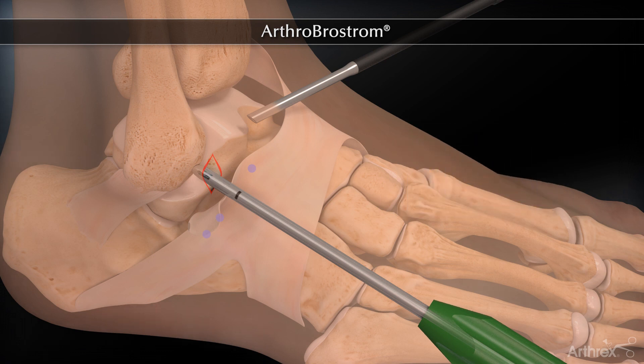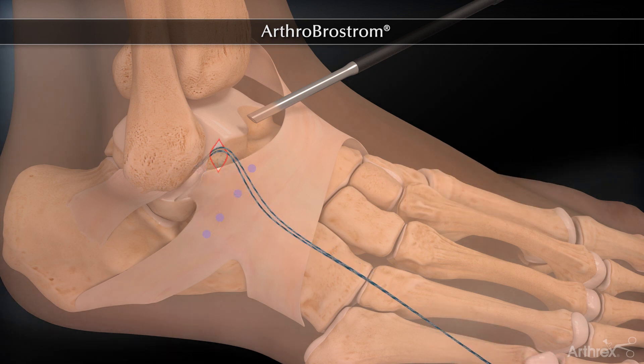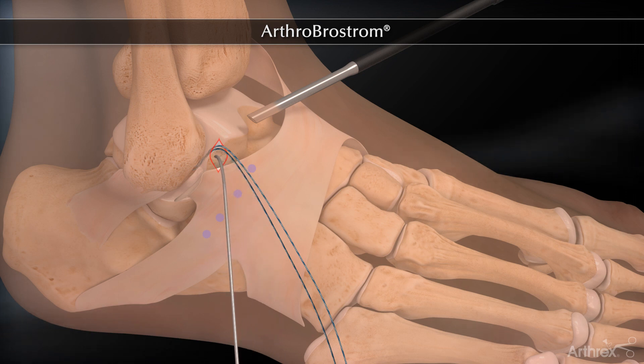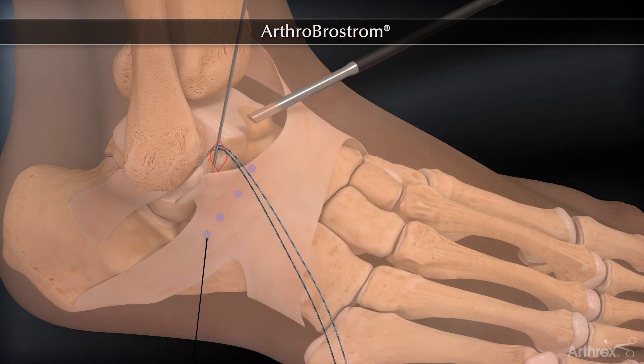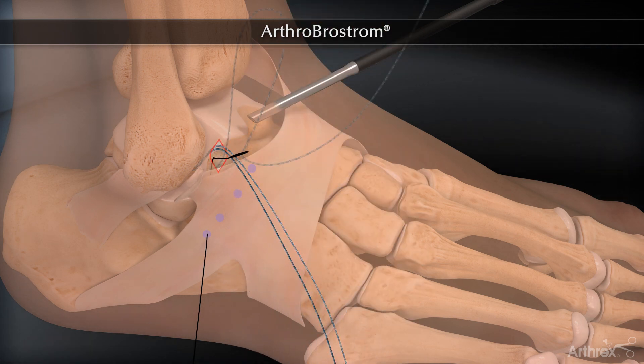A sharp-tipped curved microsuture lasso is inserted through the anterolateral portal and is brought out of the skin. A looped wire is passed through the suture lasso and the lasso is then removed, leaving the looped wire in place. One of the suture limbs is passed out through the skin with the use of the wire loop. Care is taken to assure that the suture limbs are not crossed.